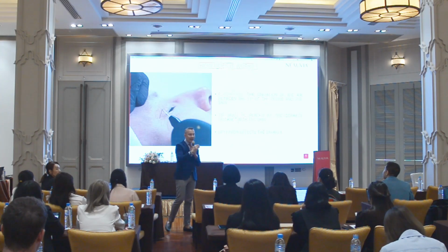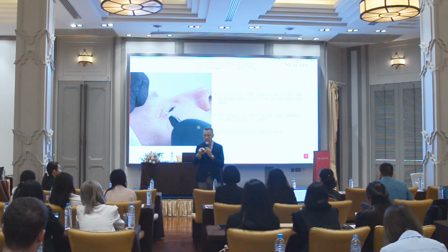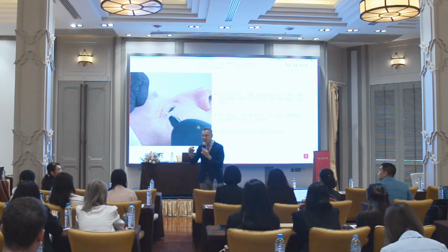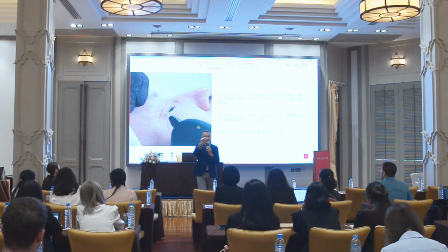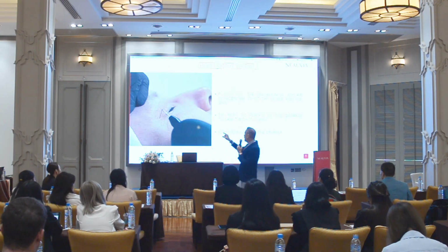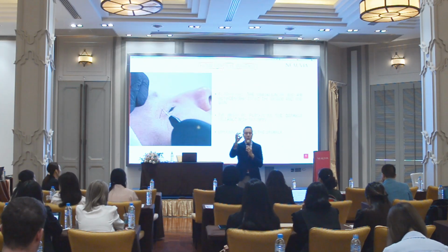How to distinguish a good plasma from a bad plasma device in terms of technology? I don't know, have you ever seen any plasma working? Yes or no? This is not a difficult question. Have you ever seen a plasma working? When you work with plasma, you leave this very small scab, very small injury to the skin. If the plasma is a good plasma, you will see this kind of situation, very small injuries. If a plasma is not a good plasma, you will see this wider, bigger.